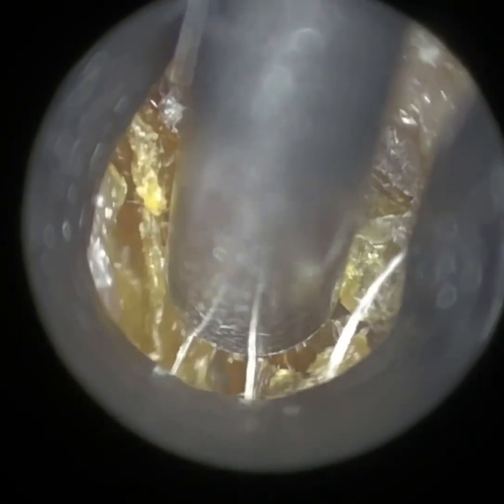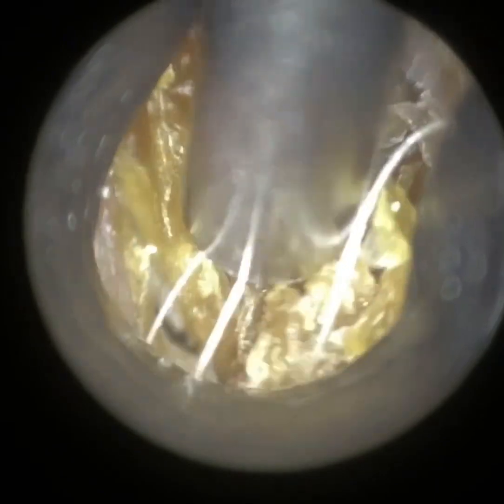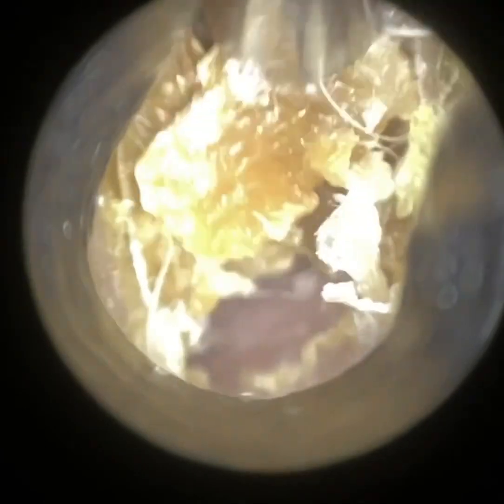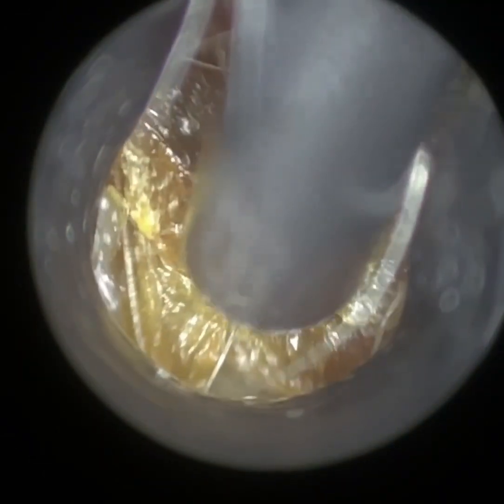And we're going to move on to the patient's left ear. This ear was a bit wider, as you can see. The roof of the ear canal was slightly dipped in this case, so the cartilage is obviously weakened in this particular patient's ear, which is causing it in the right ear to narrow, and in this left ear the roof of the ear canal was slightly drooped because the cartilage is just coming down. Again, it's really dry, crusted wax and skin.